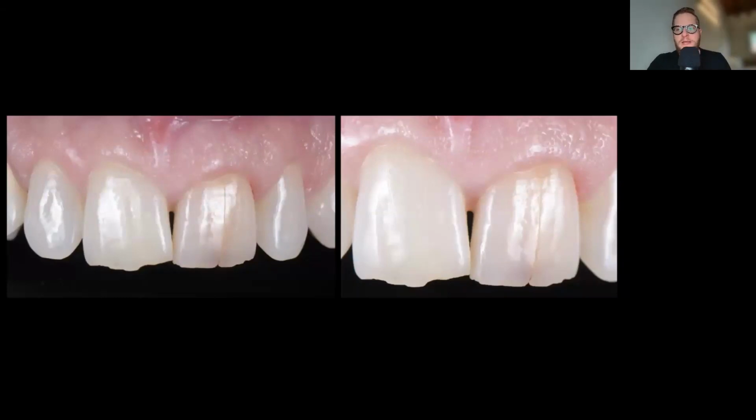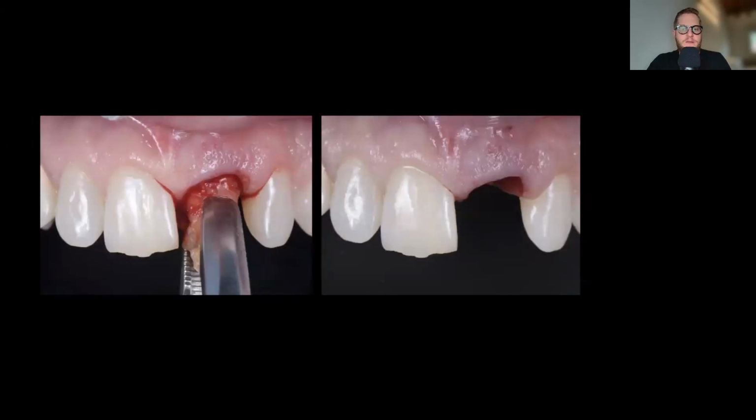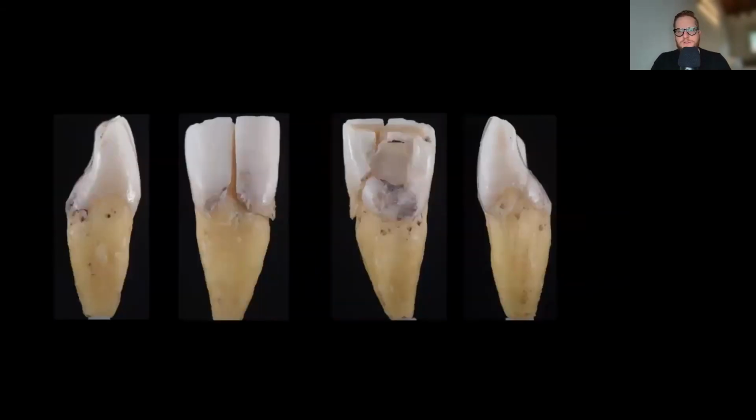And as we analyzed the crack, we thought that it was going to be very difficult for us to go through the extrusion option, and the patient decided to go ultimately for the extraction and implant placement. So we went ahead and did the extraction. In this case, we're using a forceps and periotomes to be as minimally invasive as we can. And once we removed the tooth, we saw that the fracture was subcrestal.